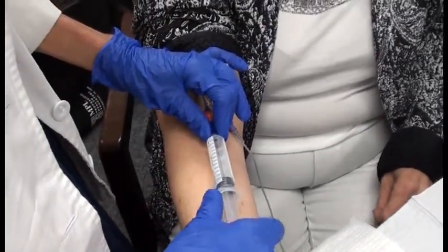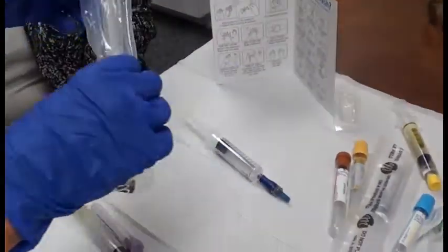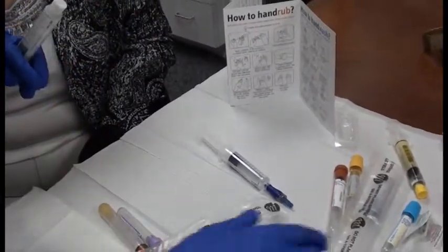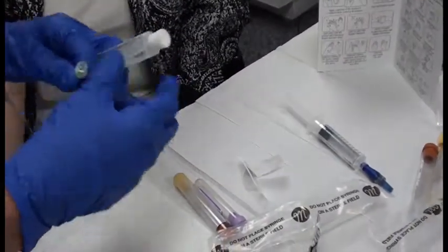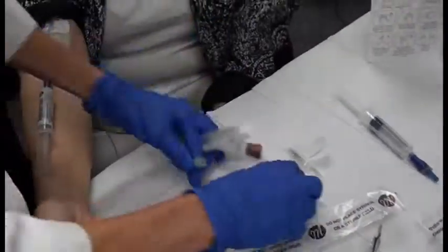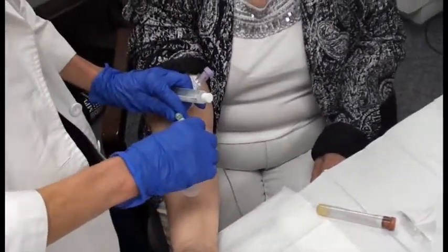Alrighty. What I like to do is get ready for the changeover. I like to have my saline ready. I'm going to put my Christmas tree in the one hand, get my saline flush ready, and have this ready to go for my first draw. Actually this one, because it's quantity determined. And I'm going to take my sample, place it here.